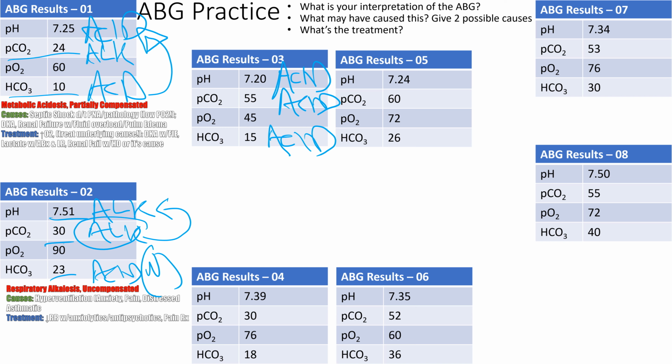You're not going to be tested on this one, but it's a fancy ABG where you have 2 at the same time. Does it happen in the hospital? Absolutely. It happens all the time. That's where they usually end up in the ICU or they end up coding, right? So we do have to be alert to these things, right? So what came first? It's kind of hard to say what came first.